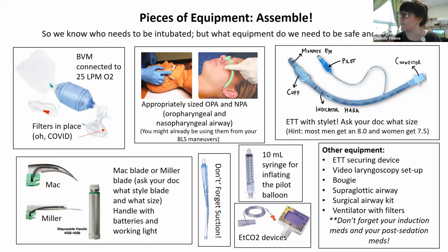There's the potential for a surgical airway, and we're going to talk about all of our planning purposes for intubation. Our respiratory staff has this really amazing airway cart. It's blue, it's downstairs in Trauma 1, and it has all of the backup resuscitation airway equipment in it, and that would include a surgical airway kit. And then we have whatever ventilator they're choosing to use for that patient, with all of the filters that are required for COVID, as we're quite commonly seeing that.